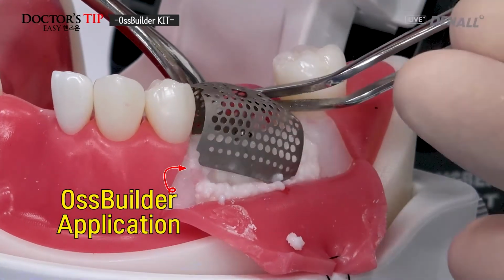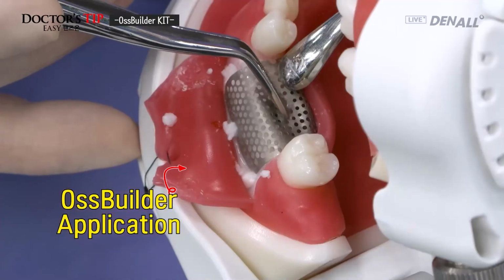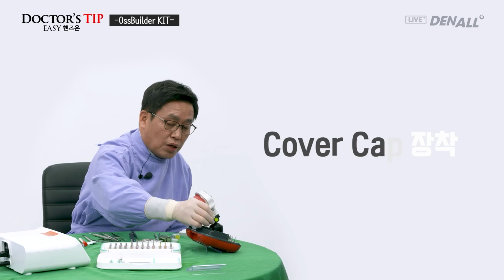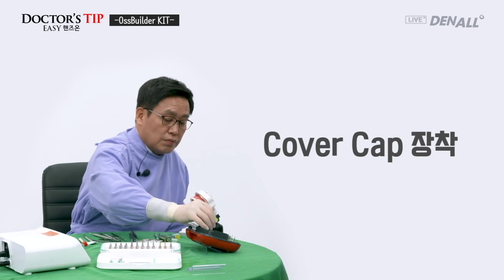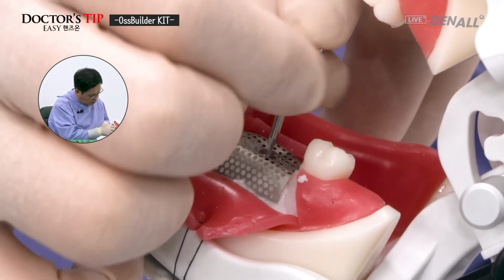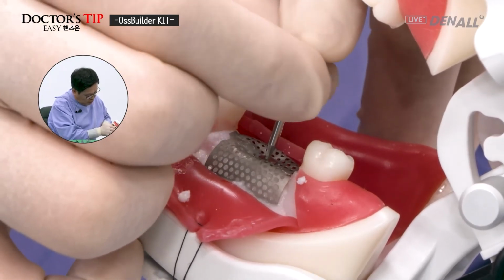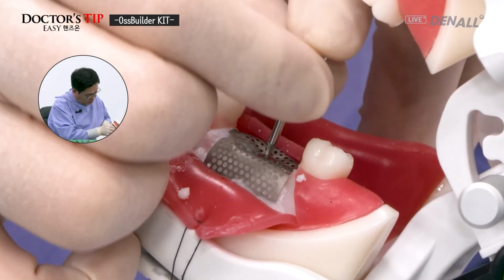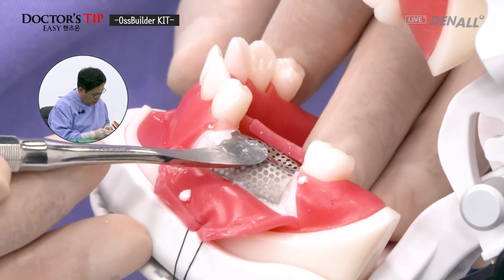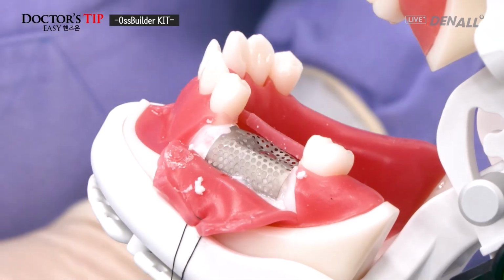And I'm going to connect the OssBuilder 3, OB3. I'm going to use cover cap now. As you can see, it's connected. It's done. In the desired position, there's a screw and OssBuilder 3 has been placed.